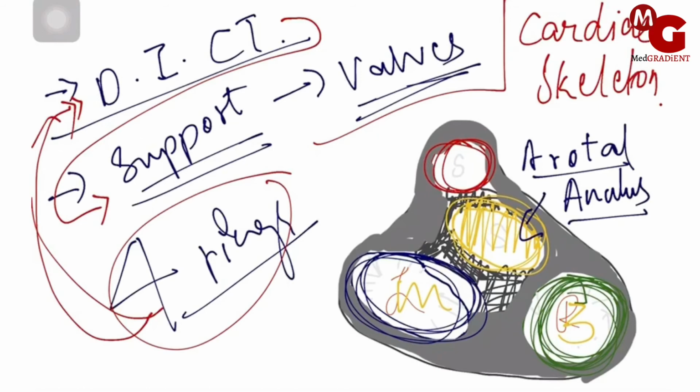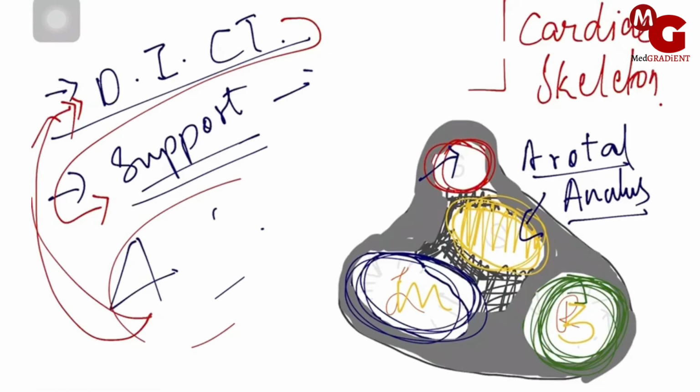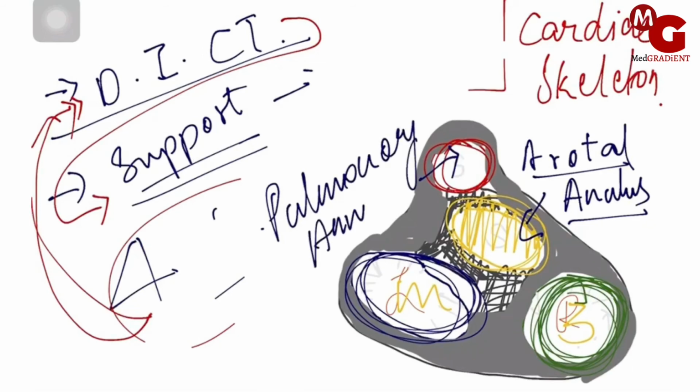And the structure here, let me clear the things, is called the pulmonary annulus, right?